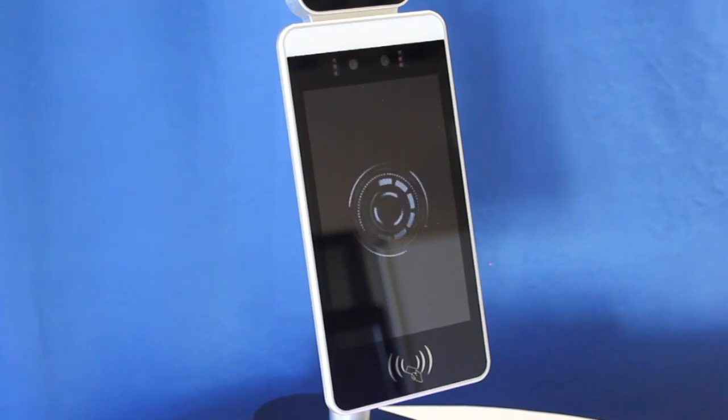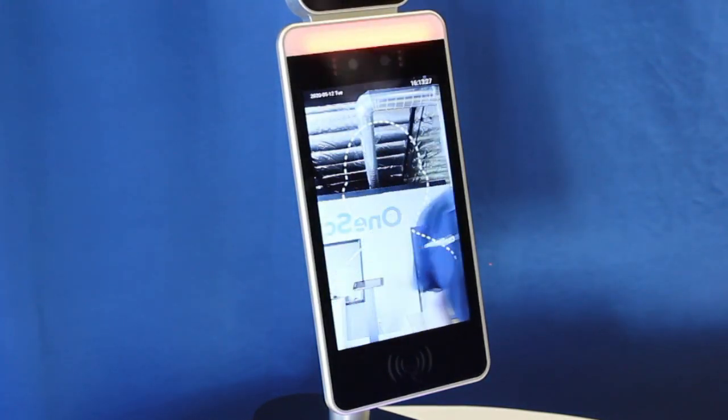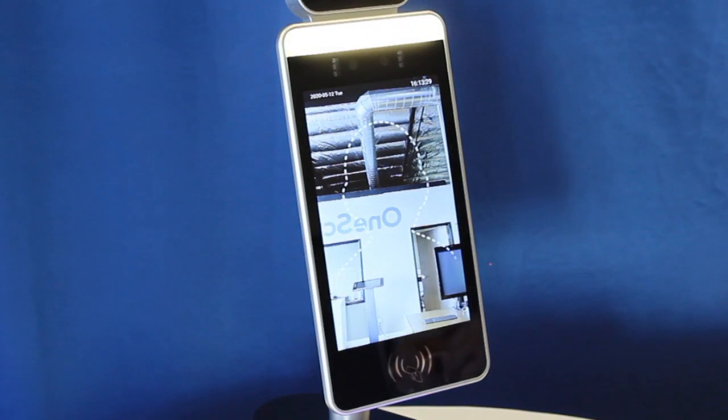I'm going to walk up to GoSafe without a mask. As you can see, it is denying me entry.